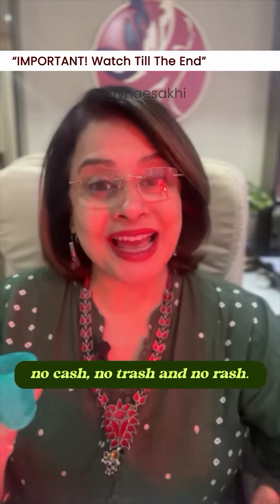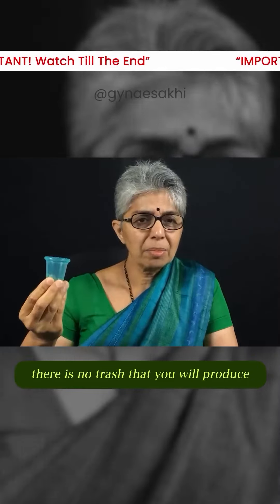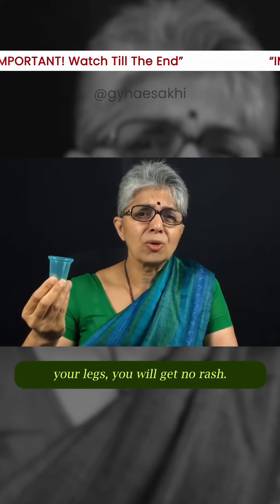No cash, no trash, and no rash — because this cup will last you 10 years. There is no trash that you will produce. And because this cup fits inside your vagina and there is nothing between your legs, you will get no rash.